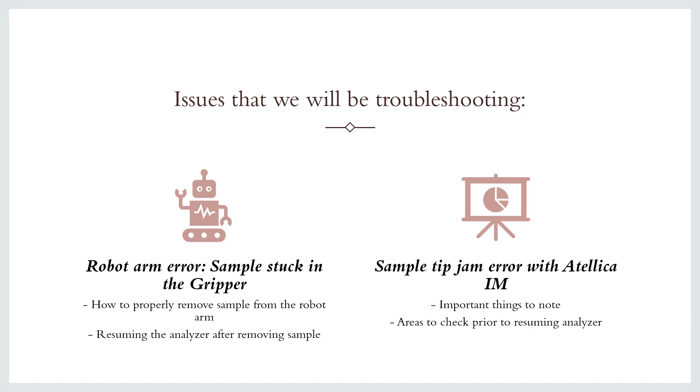The first issue we'll be troubleshooting is the robot arm error. This is where a sample is stuck in the gripper portion of the sample handler and you'll have to manually remove it to continue processing patient samples. The second issue we will be discussing is the sample tip error that commonly occurs with the IM module of the Atellica.